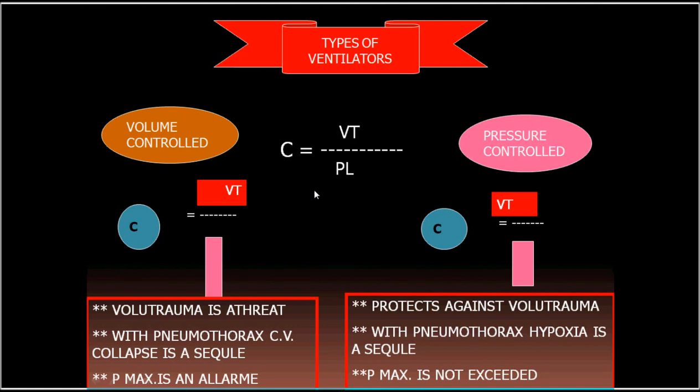Also, before we talk about this volume controlled ventilation, we have mentioned before that this is the earliest type of ventilator, which we call the volume controlled ventilation, in which we have mentioned that this is a formula. Compliance equals the tidal volume over the plateau pressure. This is a fixed part.